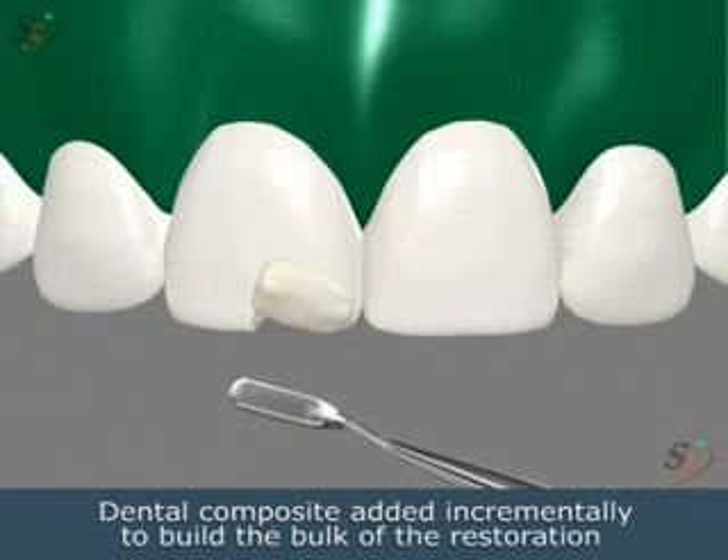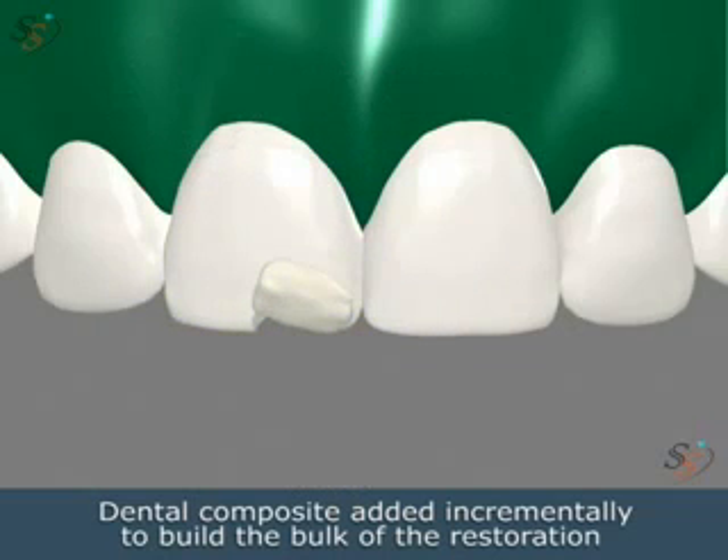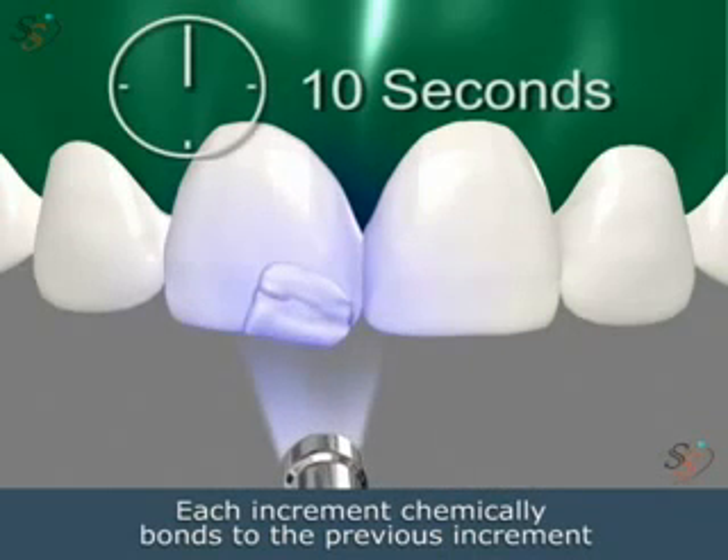Dental composite is then added to incrementally build the bulk of the restoration. Each increment chemically bonds to the previous and hardens to form a strong surface.